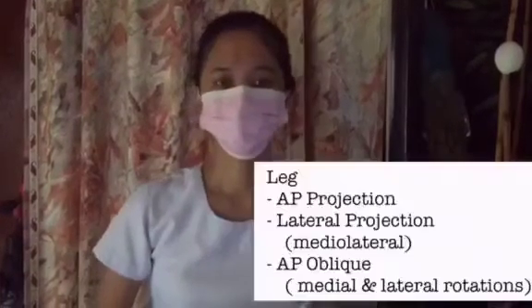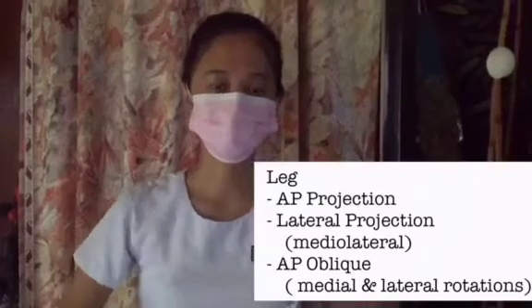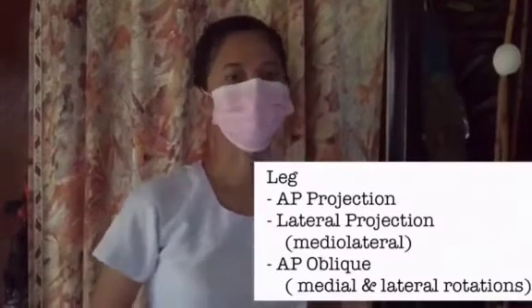I am Kyla Panchito, and for this video, we are going to demonstrate the lower leg, tibia and fibula in AP projection, lateral projection, mediolateral, and in AP oblique projection, the medial rotation and the lateral rotation.